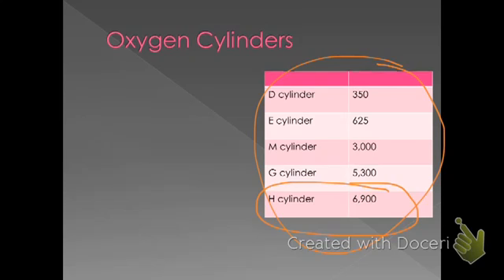Each state, each city, each facility has their choice in which type of oxygen cylinder and which size of oxygen cylinder they're going to carry. Obviously, in terms of price, it starts to increase as we go down and the oxygen cylinders get larger.